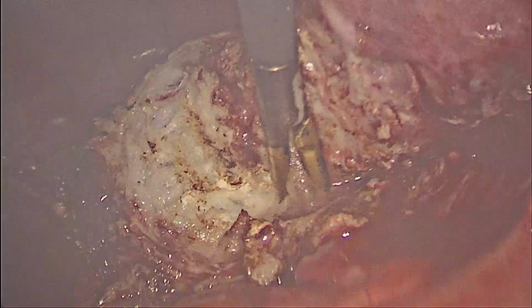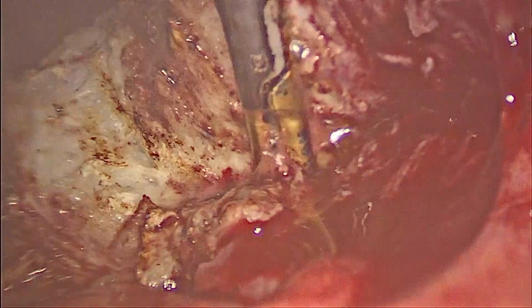Now we try to divide the left side transcervical ligament. Posteriorly also we have enough space to divide the posterior part of the vagina.